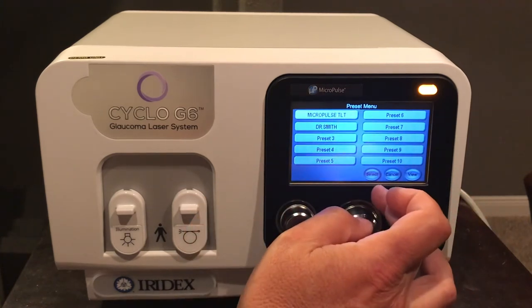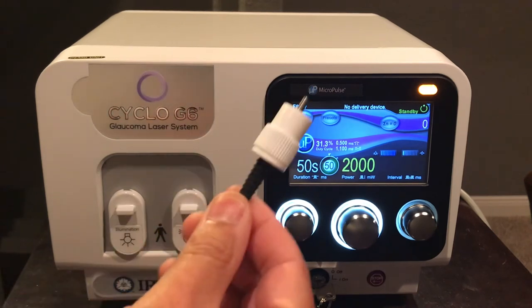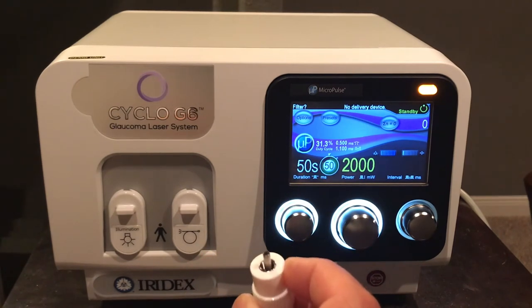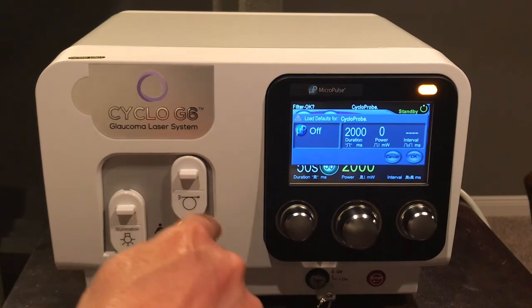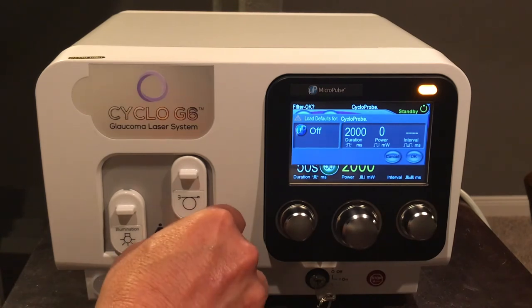With settings selected, I'll demonstrate how to insert a delivery device. The small hub on the back of the delivery device has a rubber flange covering the male end to protect the optics — remove that, open the laser port, insert the male end into the female port, and lightly twist until fully seated. An orange hue will appear around the delivery device confirming proper engagement. If this does not light up, there is an error or the device is not fully seated.